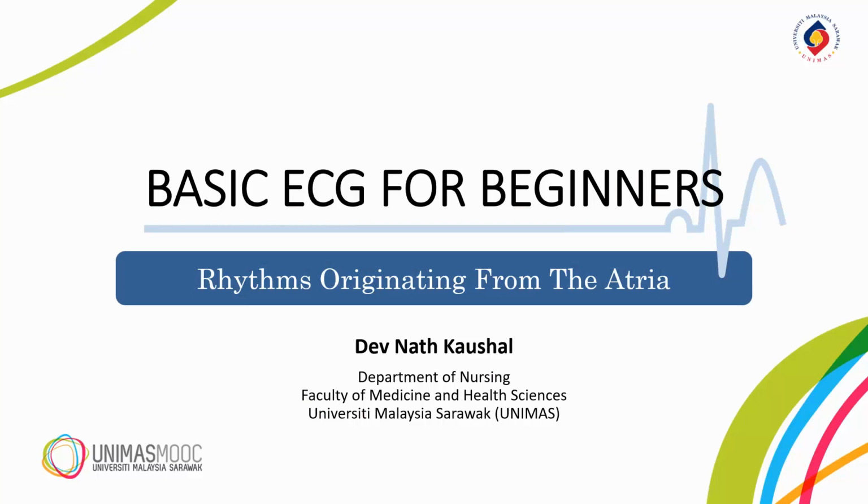Welcome back to our lecture series on basic ECG for beginners. In our last lecture, we looked at rhythms which were generated by the SA node, which is what you expect the normal pacemaker of the heart to be. If you accidentally skipped that lecture, it is worthwhile to review that lesson before moving into this one.